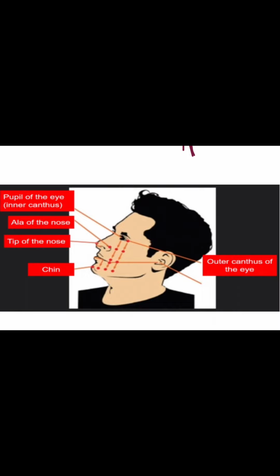The same goes for the landmarks in the mandibular except for the incisors, in which the mandibular uses the chin as a landmark in contrast to the tip of the nose as used in the maxillary.